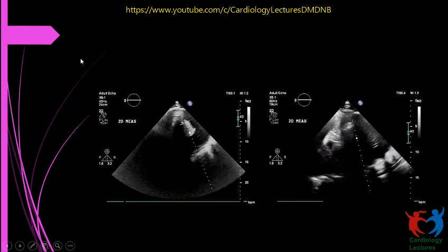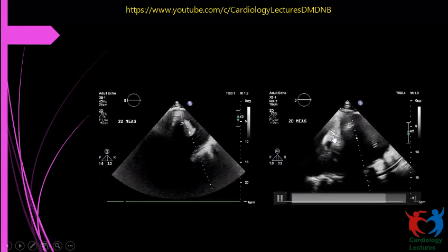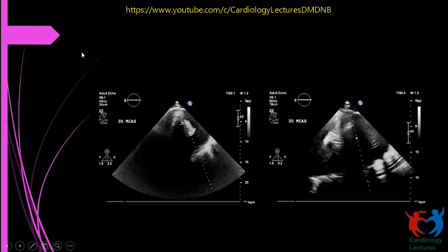This patient didn't have fever. He was post-operative day 5 or 7 and had acute distress, a change in respiration. When we did a pleural scanning, we found this effusion and a collapsed lung. Once the tube was put, within 4 to 5 hours the patient was settled. On the second day of the procedure, the tube was removed and the patient was discharged back to the ward.